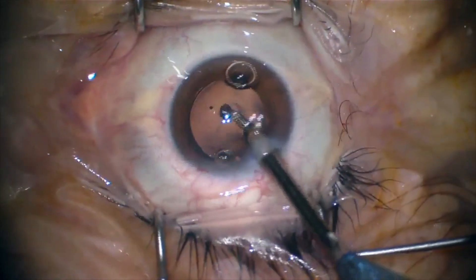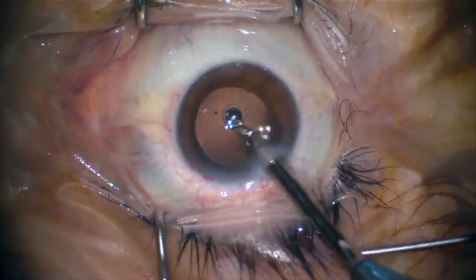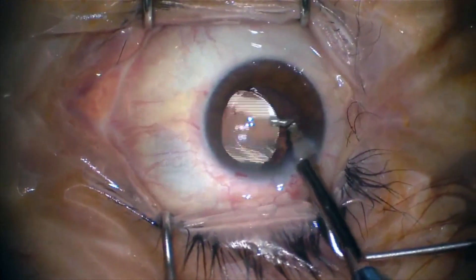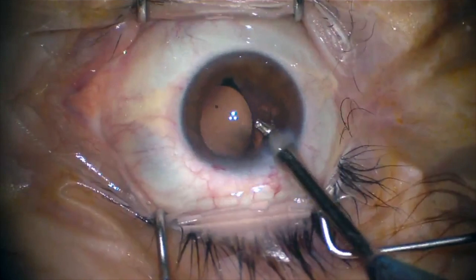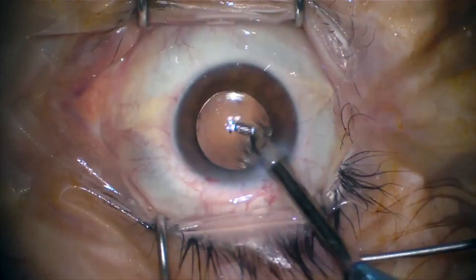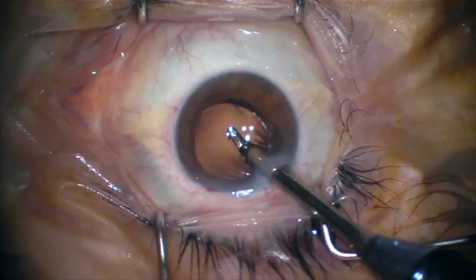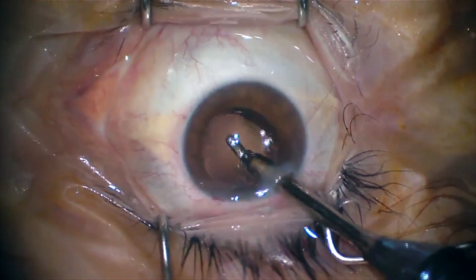Finally, I recommend to all my residents to aspirate viscoelastic from the anterior chamber and from behind the IOL, in order to avoid a myopic shift in the refraction during the post-operative period.